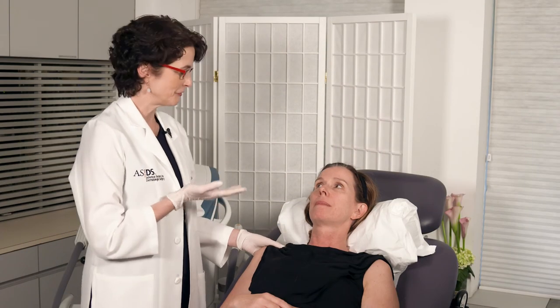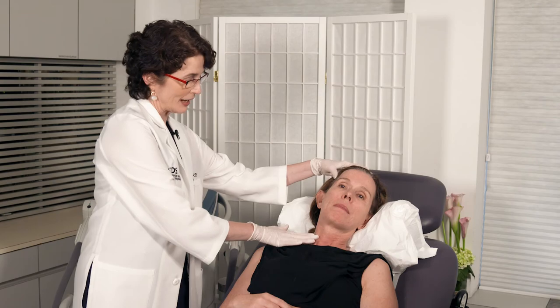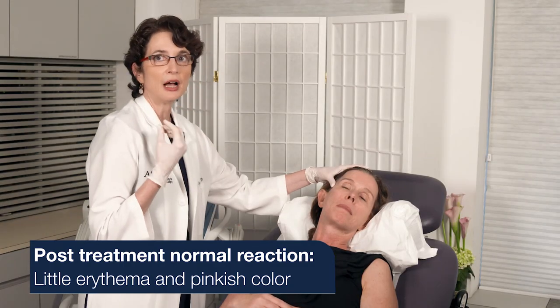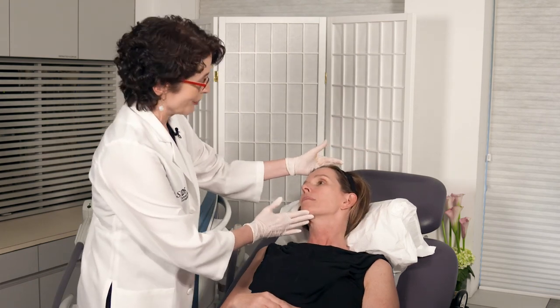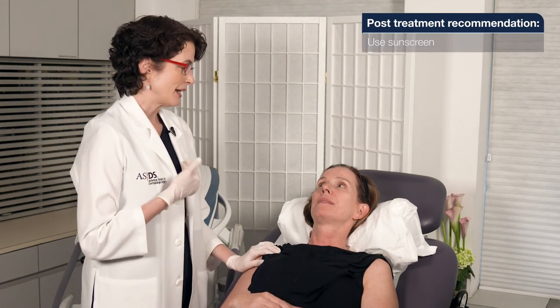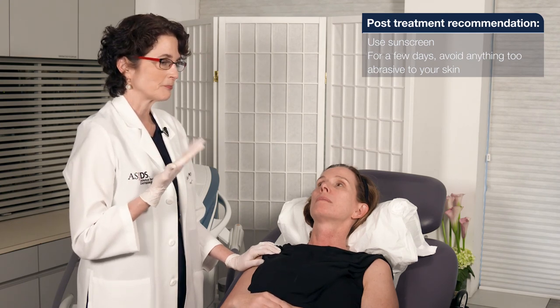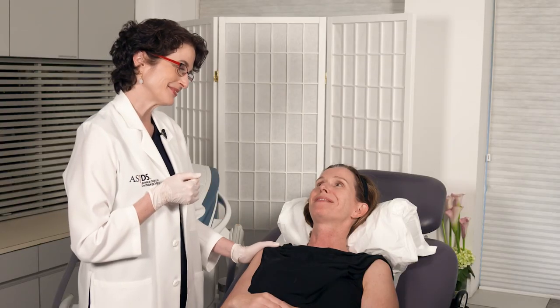We've finished the treatment. She's a little bit pink, especially the neck which I treated last. I can see a little erythema around the collections of pigmented lesions, but I don't see any hiving, edema, or anything concerning. What I'm going to ask Mimi to do is put her sunscreen on before going out, and for the next couple of days avoid anything too abrasive. If she's using retinol or a retinoid, just take a couple of days off, and that's it.